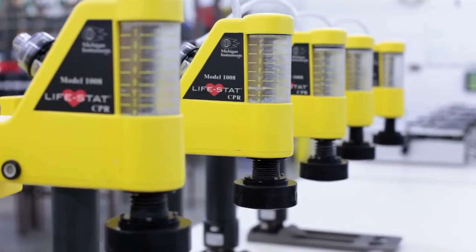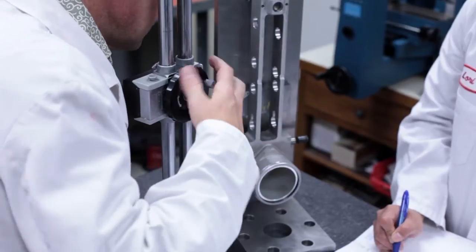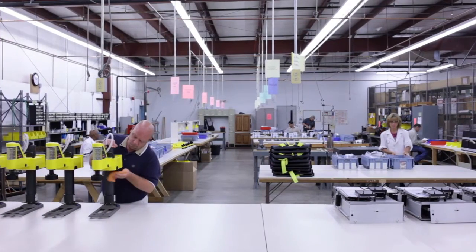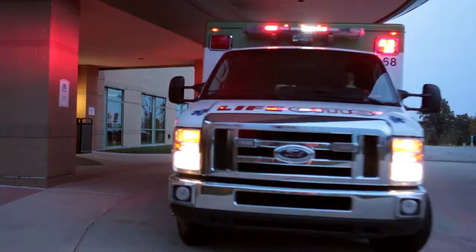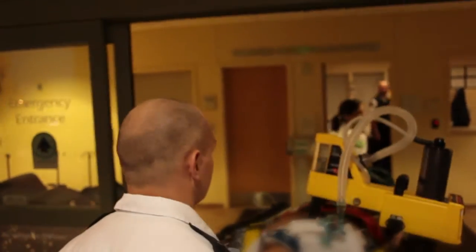The Lifestad is manufactured in the United States by Michigan Instruments. It's assembled, tested, and ready for shipment at their facility in Grand Rapids. Michigan Instruments has been in the business of saving lives for nearly 50 years and has an impeccable reputation for building quality products, earning the respect of medical professionals around the world.